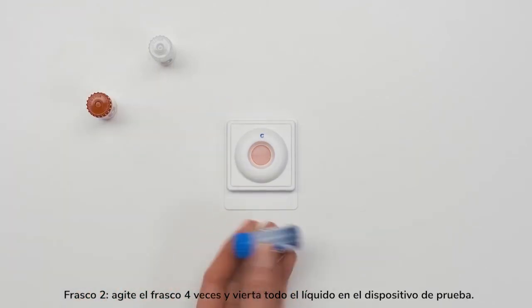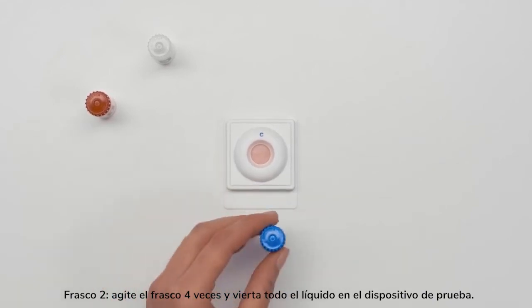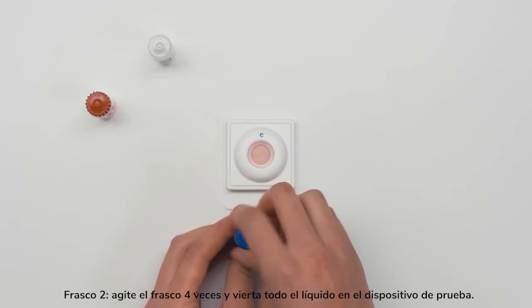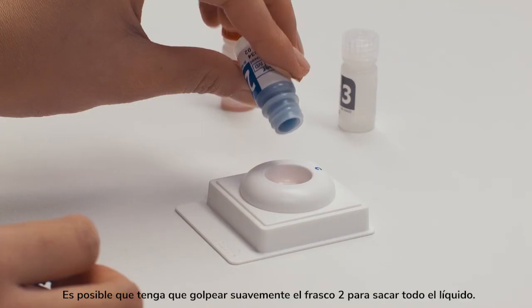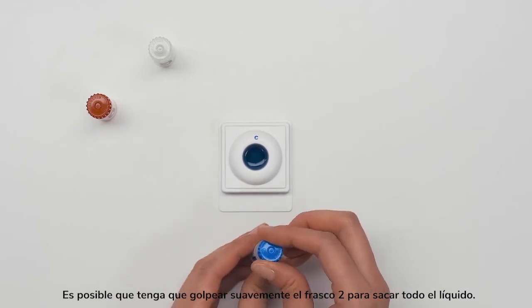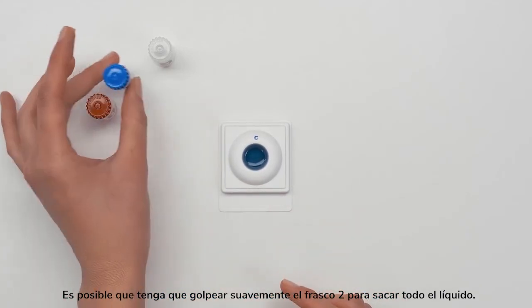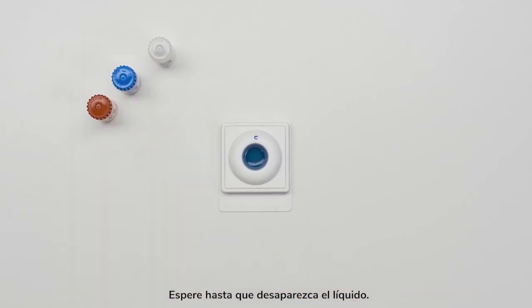Bottle 2: shake the bottle 4 times and pour all of the liquid into the test device. You may need to gently tap Bottle 2 to get all the liquid out. Wait until the liquid disappears.